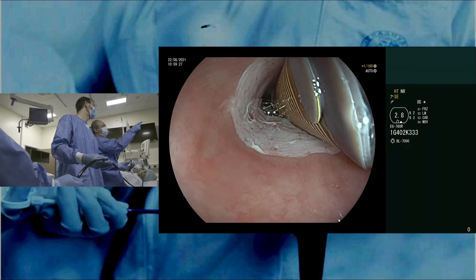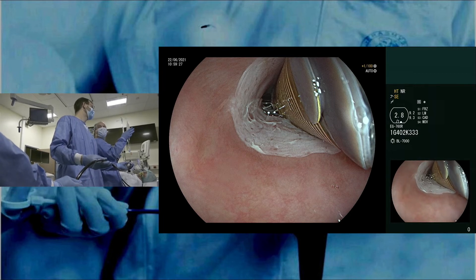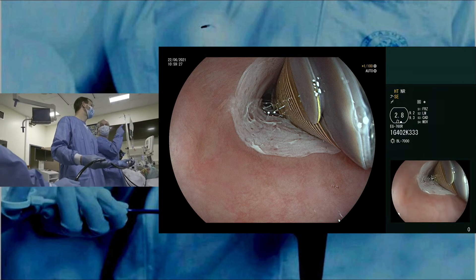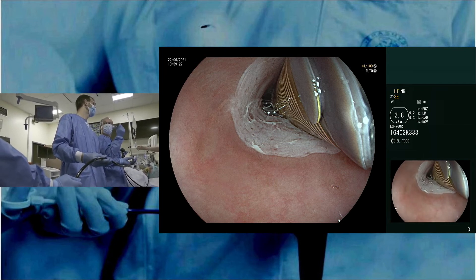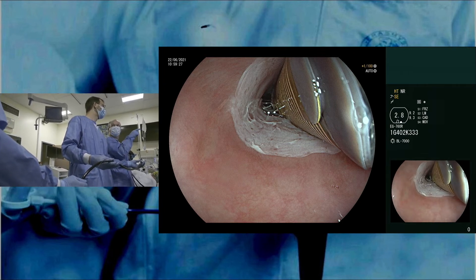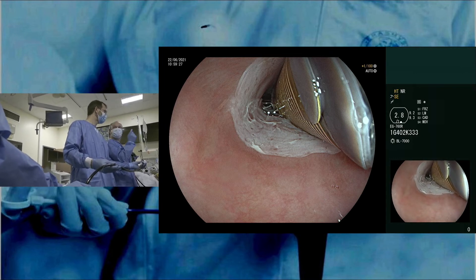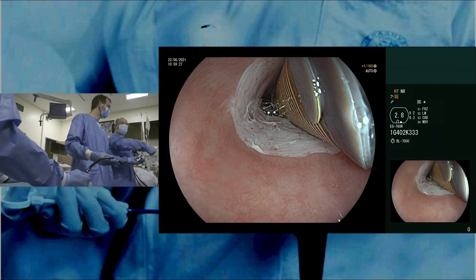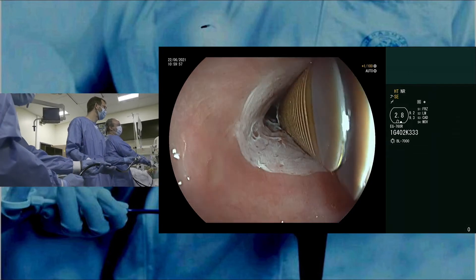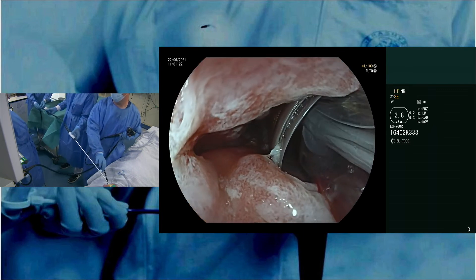If you look here, you can see this rim of the electrode, which is actually quite sharp — a bit like a razor blade if you don't take care. When we come back later and we know there is a stricture, there are two important things to avoid complications. First, make sure the shape of the balloon is small again before removing it, so there's no resistance. If there is resistance, you have to come back and twist clockwise again. There have been some lacerations due to careless removal.